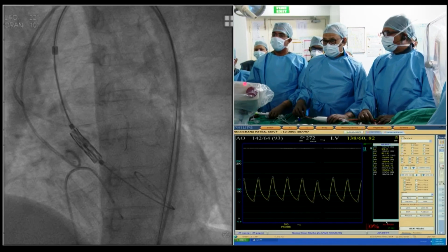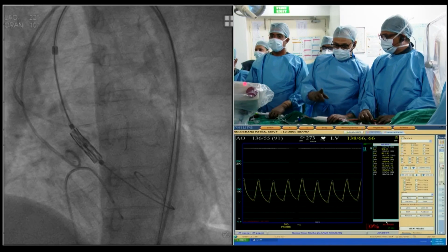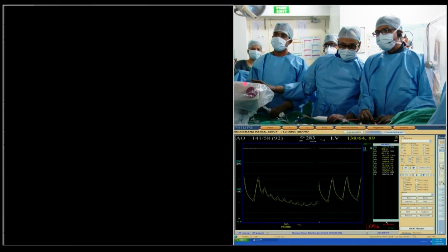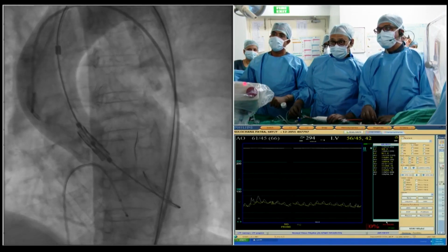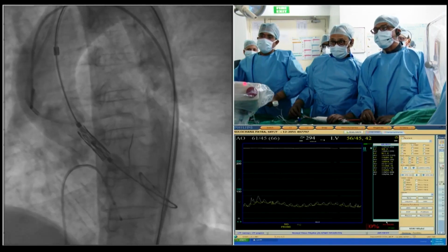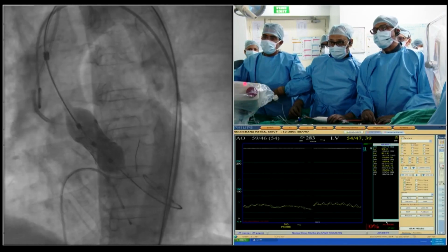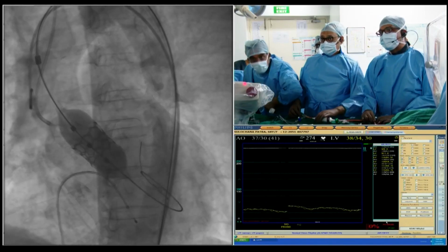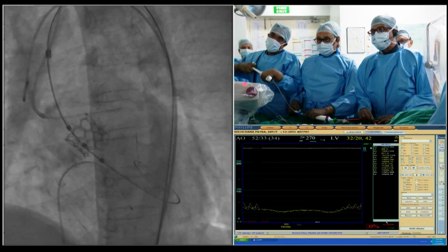This will be the valve deployment. Start pacing it, please. It takes a couple of seconds before. Yeah, and we'll do a slow inflation. So the pacing is now picked up. Okay, inject. Okay, pigtail is back. Go inflate. Inflate slowly. Go ahead. Commit. Push it. And pull back, pacer off.